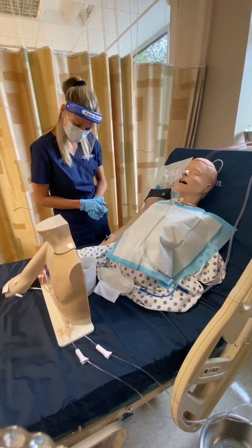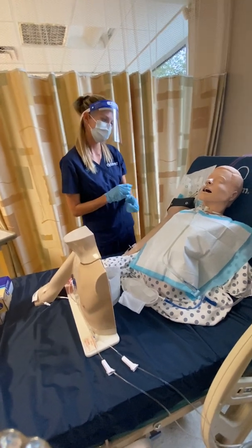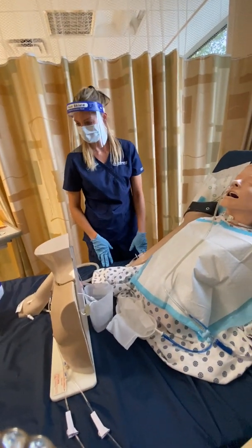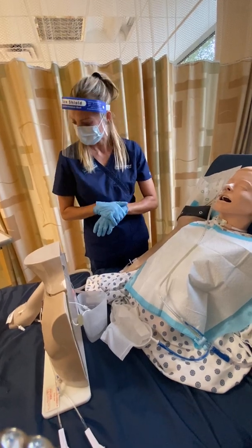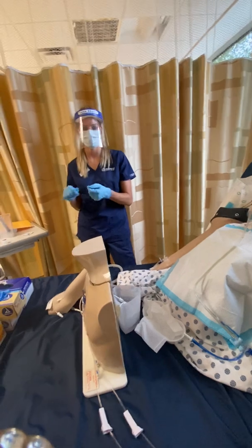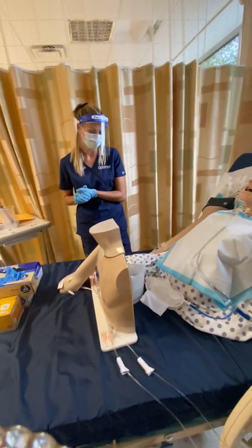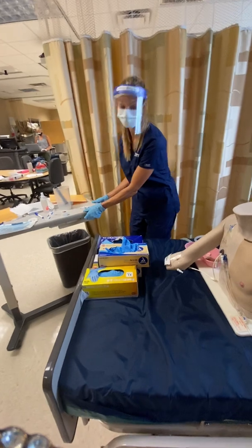Okay, all right. I think we've got everything all set for you, Jane. Are you feeling okay? And she says that she's feeling okay. Okay, so then I would just make sure Jane was comfortable and give her her call light. And then gather up all my supplies and throw everything away that I needed to, clean everything up, wash my hands up, and then document all of the stuff that we just did.